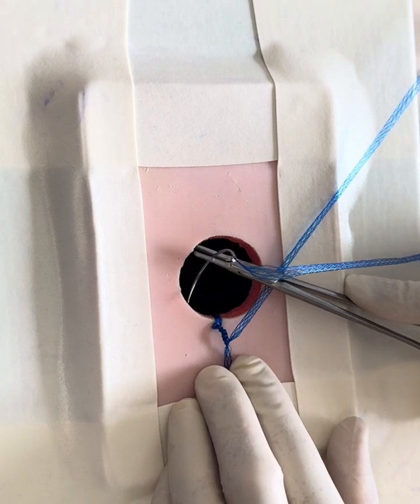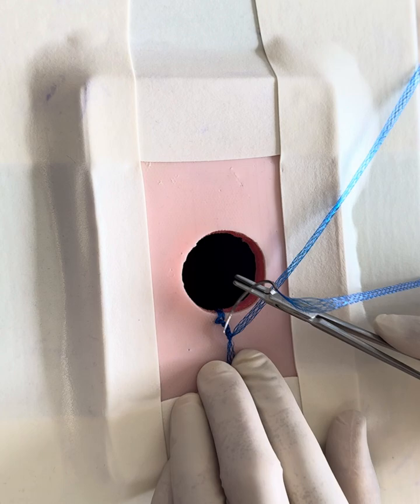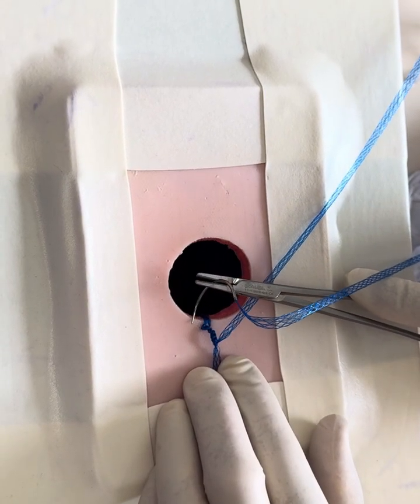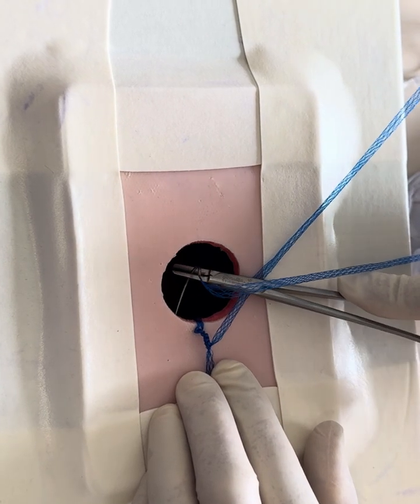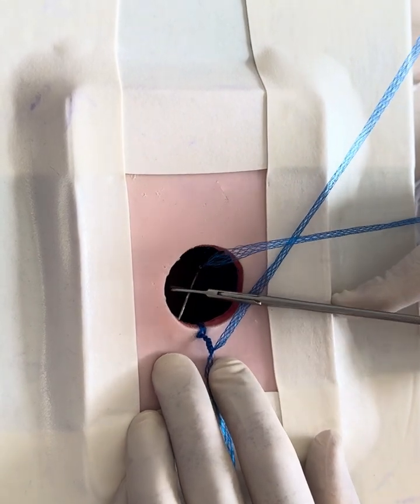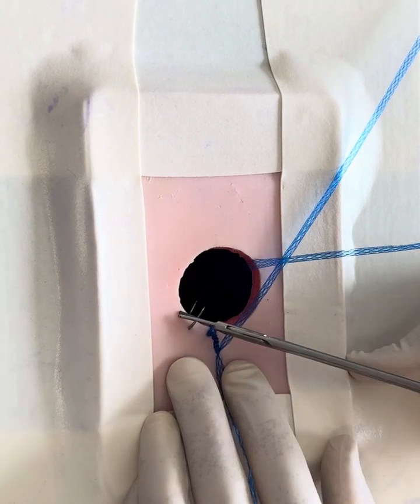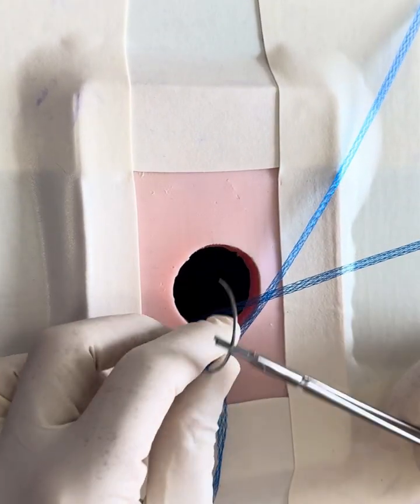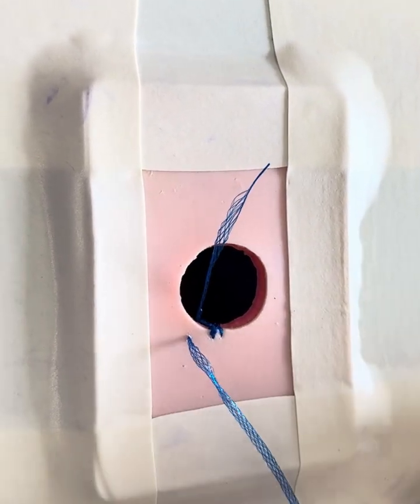So this would be our parastomal hernia, or if we're reinforcing a primary hernia incision, we're then going to aim for 5 to 10 millimeter bites, or 5 to 10 millimeter progress around the circumference, and then 5 to 10 millimeter bites through the entirety of the muscle and fascia layers. But obviously the skin is not included in this part of the process.